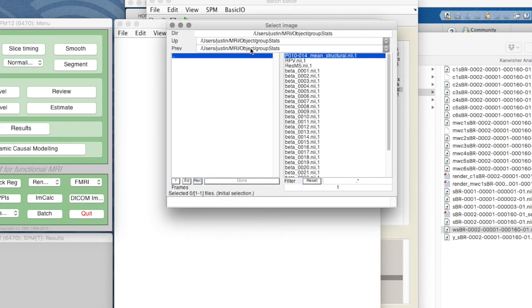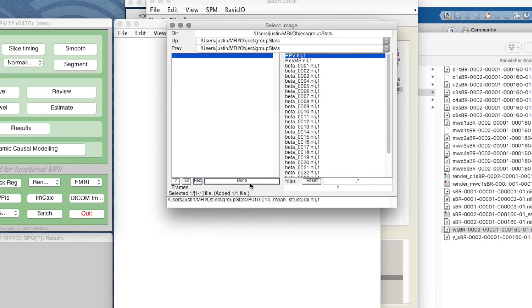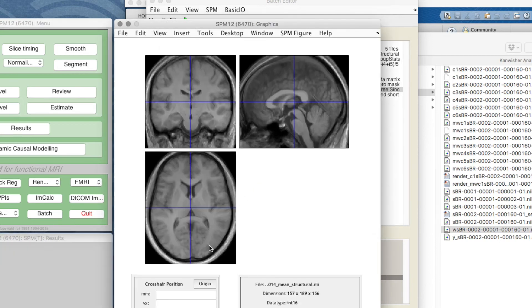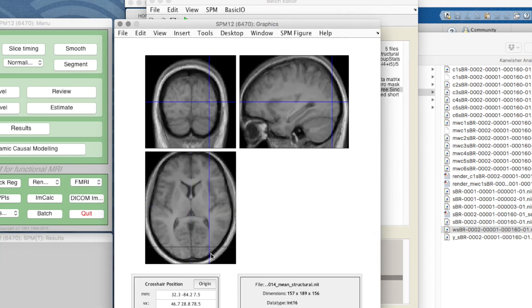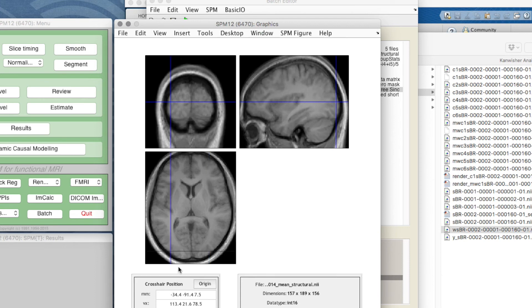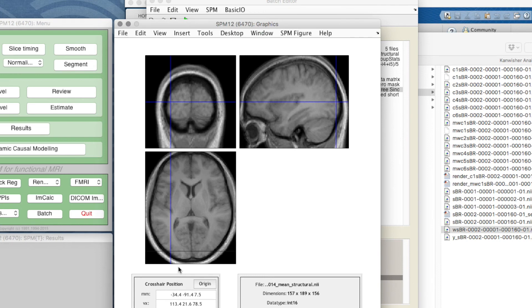In our group stats we have what we call our participant 10 to 14 mean structural. I can now select that and load it. This is the mean of our participants. If we're going to look at group data, five people's data, the average of it, we should really overlay it on the average brain so we don't make the mistake of saying we definitely have this in a particular structure when we don't. It still actually looks quite good and shows you that the warping process works very well. That is a nice warped mean that we can use for our overlays.